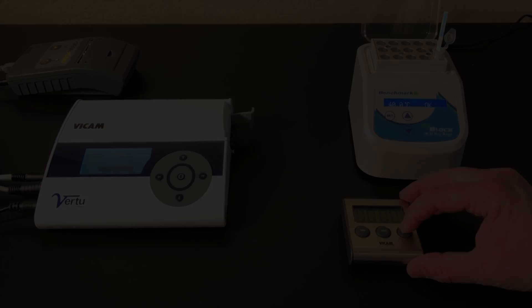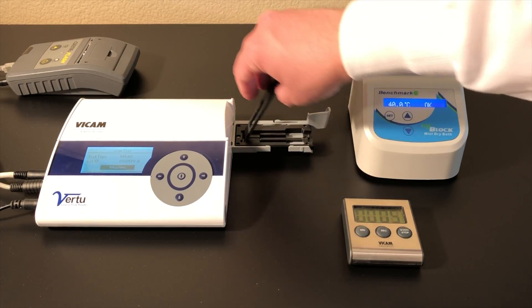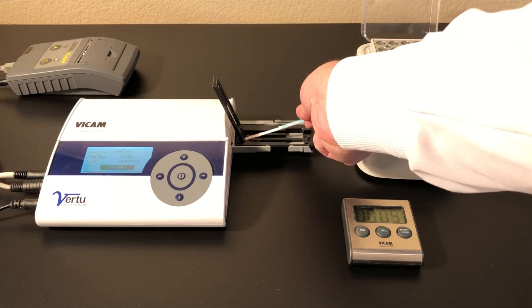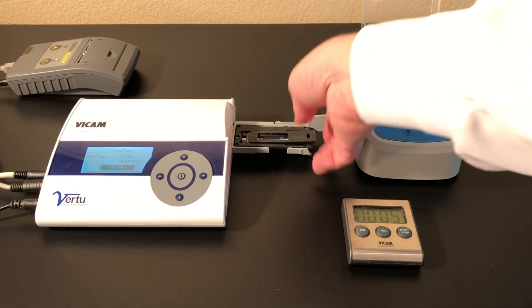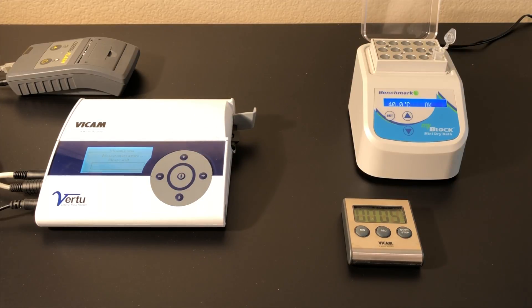Incubate for 10 minutes. After 10 minutes, place the strip logo side up with the logo on the right side of the holder. Close the drawer. Press the center button on the Virtu strip reader. Results will be shown on the screen in a few seconds.